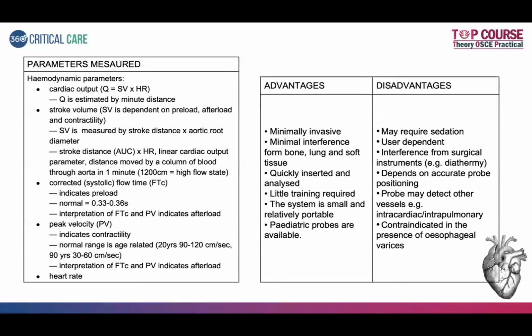What are the advantages? It is minimally invasive, quickly inserted, little training is required, and various age group probes are available. But it may make the patient require sedation. There could be user dependent changes in the Doppler values. The probe may detect other vessels. It may be contraindicated in esophageal varices.